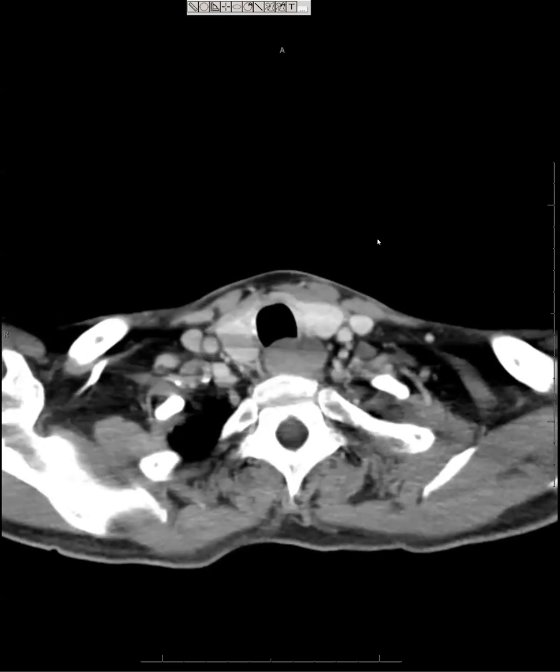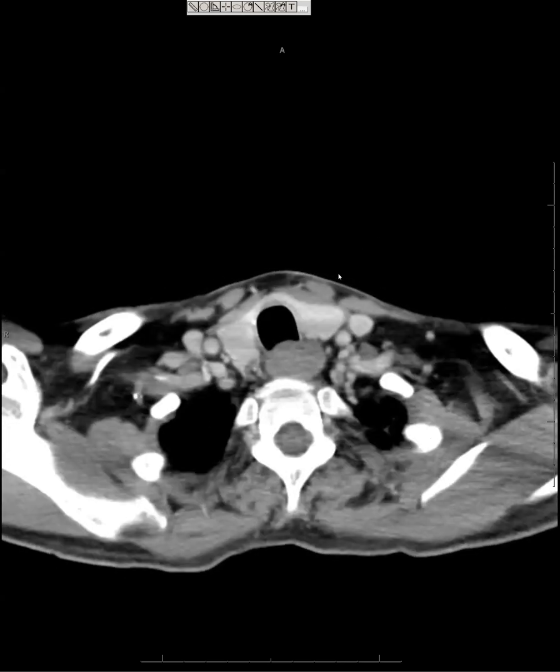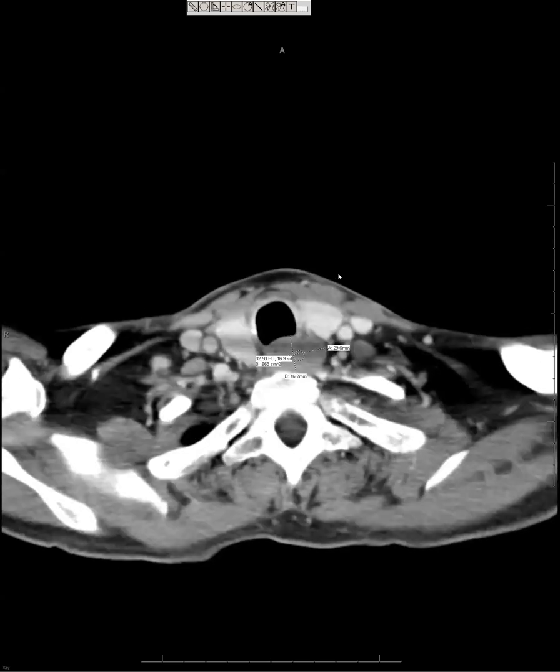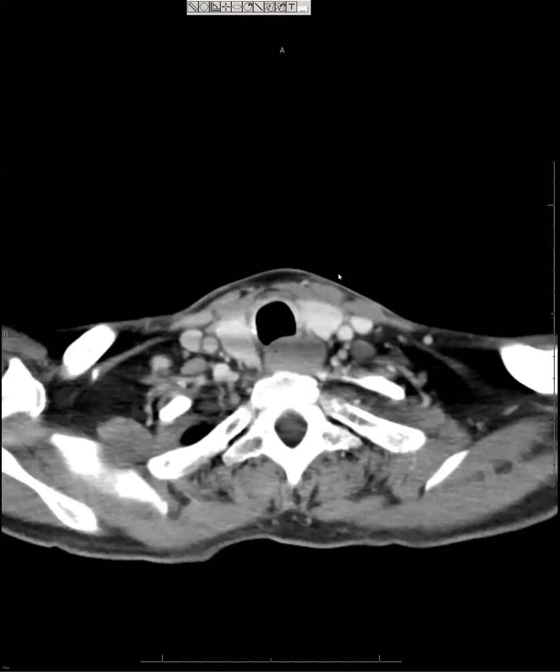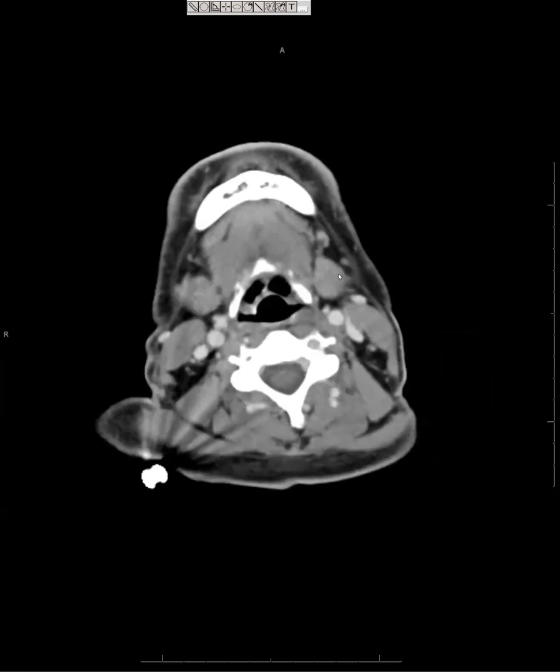Yeah, that's cool. I definitely also favor a leiomyoma, or maybe a GIST, something round, extramural, submucosal kind of thing. I also noticed that a lot of my patients that I've been following up have been lost to follow-up recently, and I don't know if it's because of COVID or just, you know. I wonder if that's COVID related. People are a little bit reluctant to pursue care for things that aren't bothering them too bad. Yeah. So. Cool.